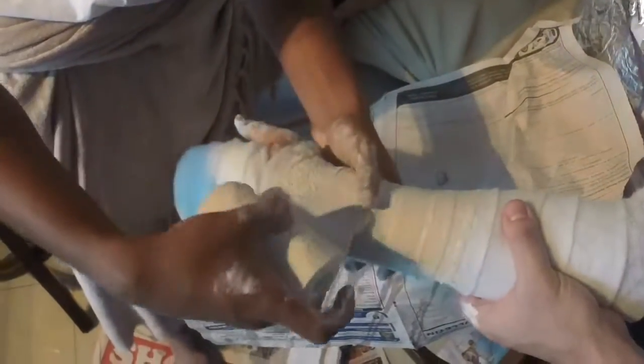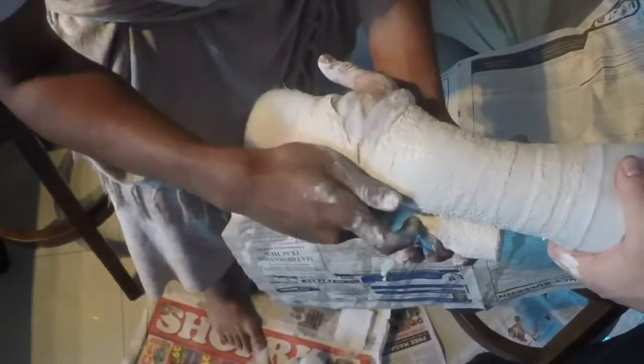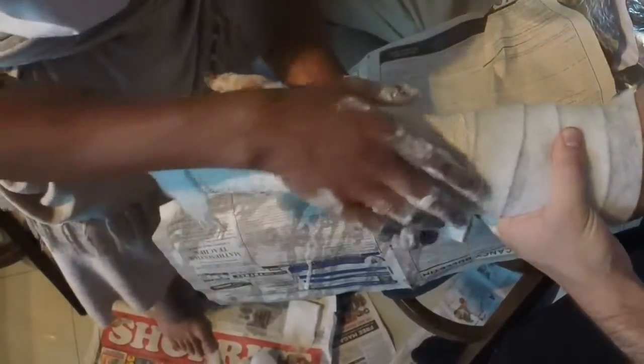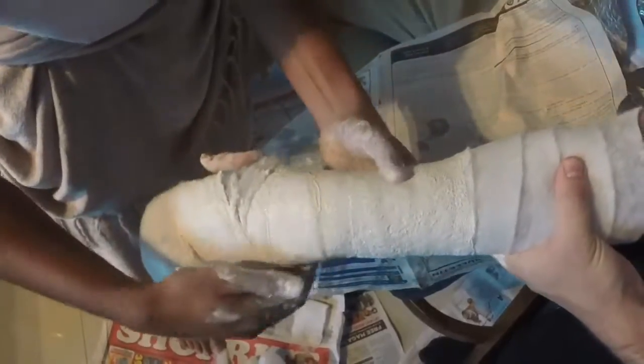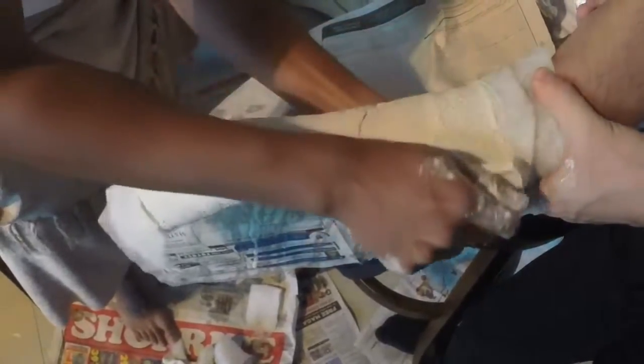When applying the plaster of Paris, one can begin at the site of the fracture, and care should be taken when applying it to the hand itself, as the distal palmar crease should never be covered. This can be achieved by bunching up the plaster when placing it around the distal web space, as shown in the video. It is important not to impinge flexion of the palm, as when the MCP joint is flexed, the flexed tendons are at their longest, and if this movement is prevented, a fixed contracture of the tendons can develop. A rim of felt band is left intact at either end of the plaster, and this will be folded over and covered in the second layer.